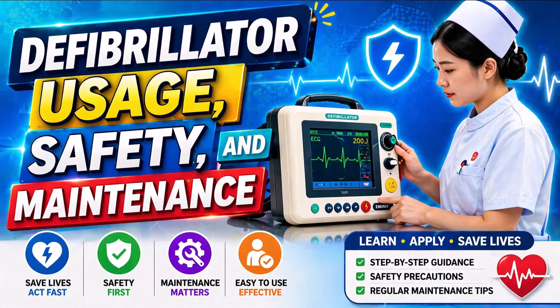For electromedical technicians, maintenance and testing of defibrillators are vital responsibilities. Routine maintenance includes visual inspection, battery checks, electrode condition assessment, and verification of charging and discharge functions. Batteries must be fully charged and replaced according to manufacturer recommendations.